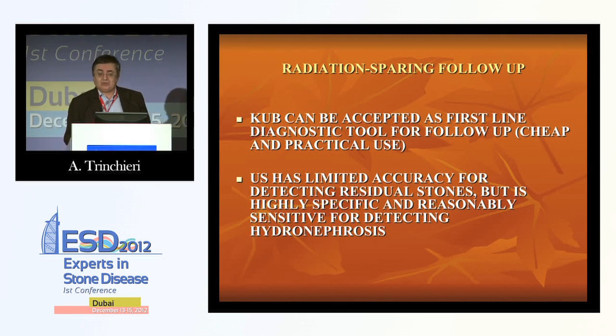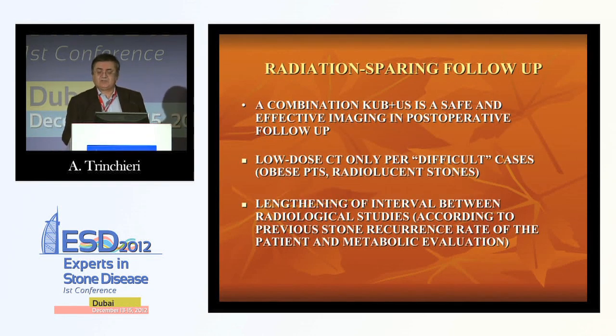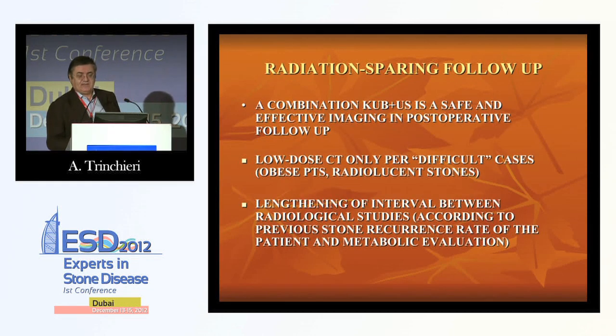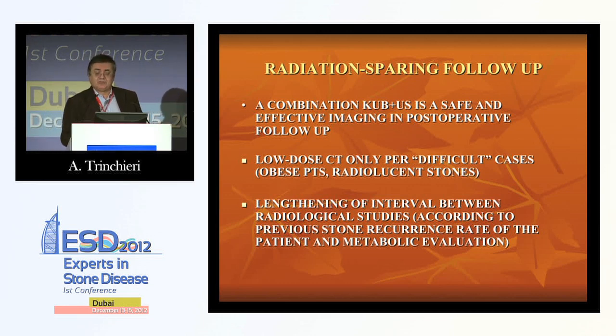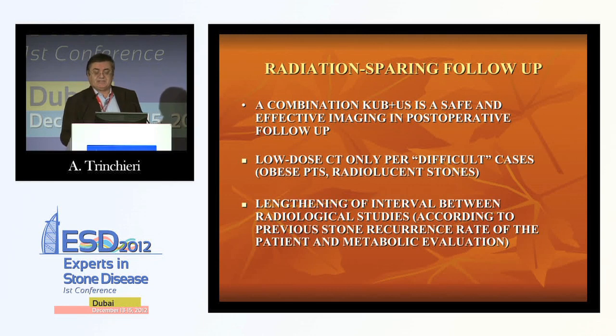And we have also to consider that ultrasound has a limited accuracy for detecting residual stones, but is highly specific and reasonably sensitive for detecting hydronephrosis. So a combination of these two types of imaging is safe and effective in postoperative follow-up. And low-dose CT should be reserved only for difficult cases, for example obese patients or the radiolucent stones.